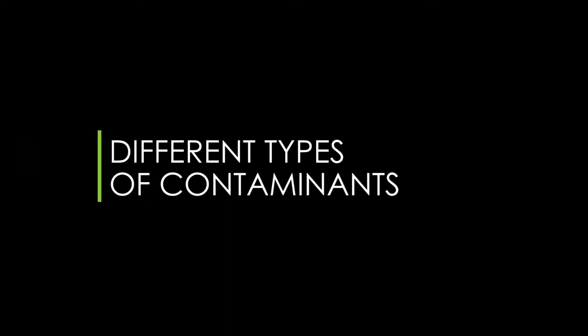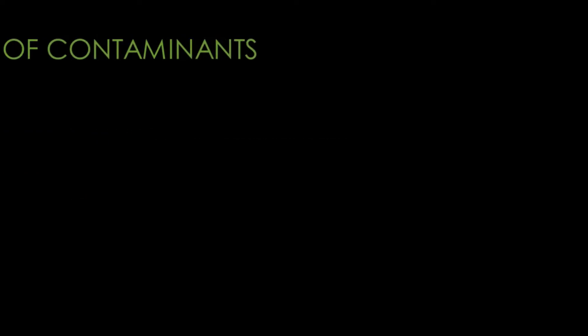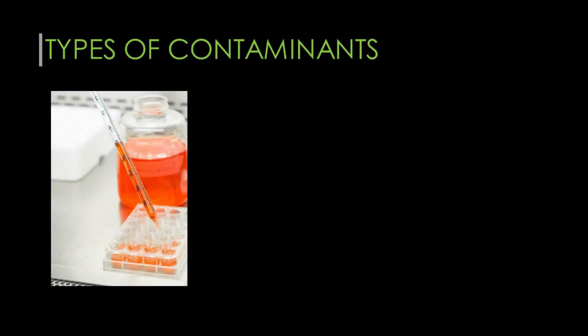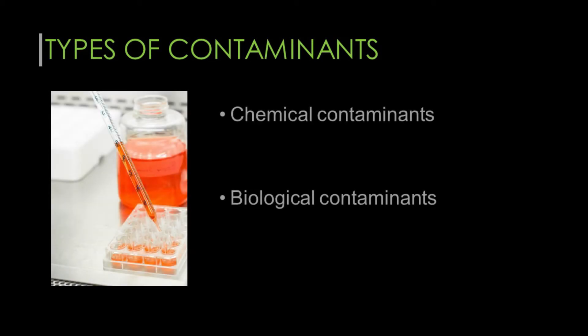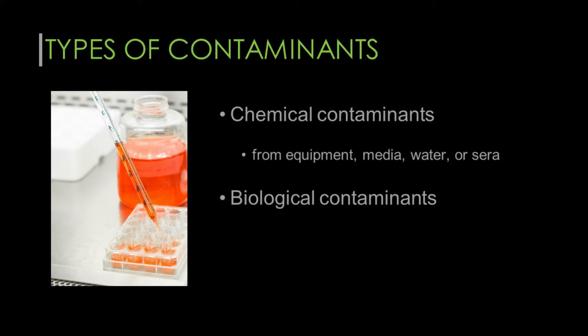What are the different types of contaminants in cell culture? There are two types of contaminants: chemical contaminants and biological contaminants. Chemical contaminants usually come from equipment, media, water, or serum. Biological contaminants include bacteria, fungi, yeast, and viruses.